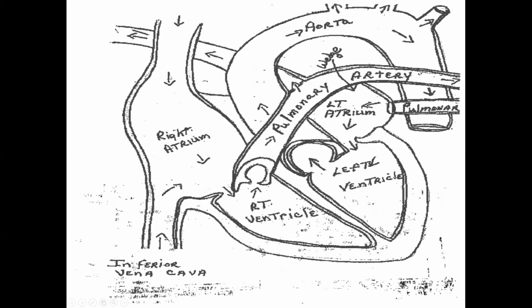Okay. So when we were talking this morning, we had that triple lumen, or central venous catheter, whatever you want to call it. And the tip of the central venous catheter really dead ends in the superior vena cava. It's not all the way into the right atrium. And the only thing that we can measure from a triple lumen catheter is the right atrium pressure, or CVP.